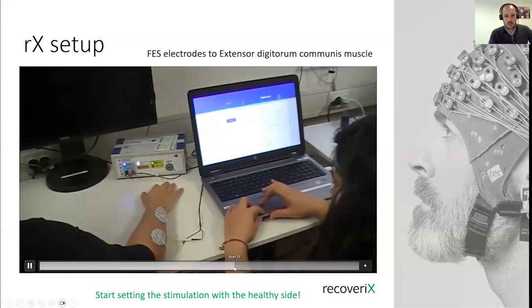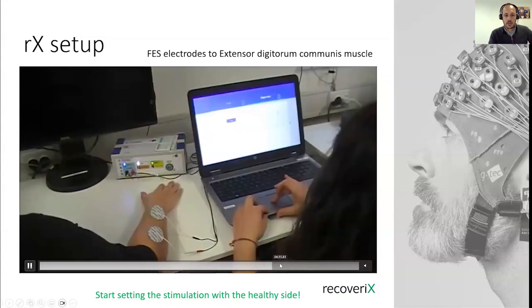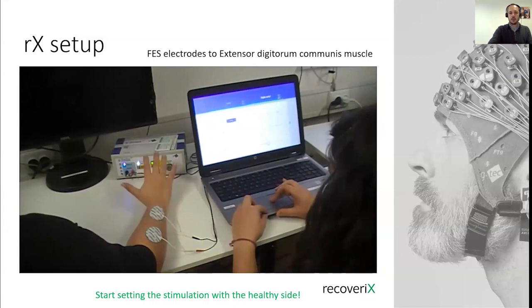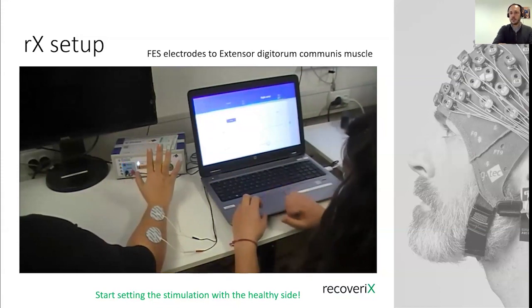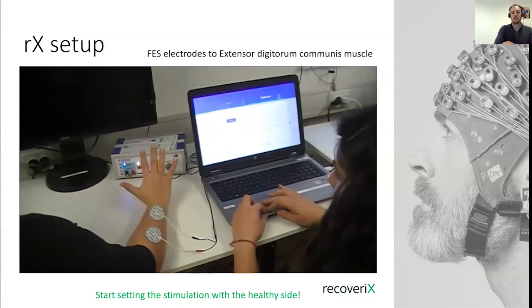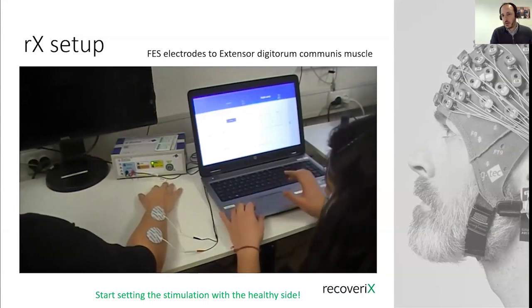So at the beginning, this can be tricky, because if it's the first time that you are placing the electrodes, maybe you are not very confident in yourself or whatever. It's no problem because it's totally safe. But at the beginning, maybe you need more time. But after some sessions of training, you can do it really quick.